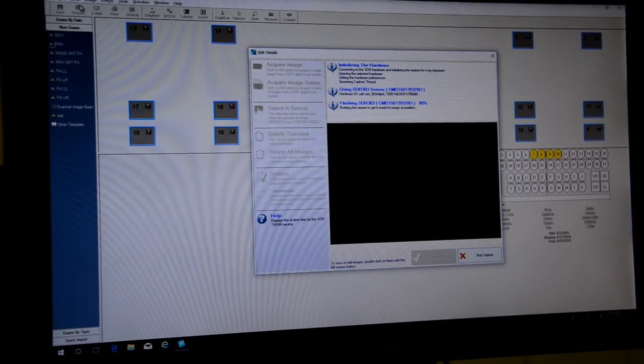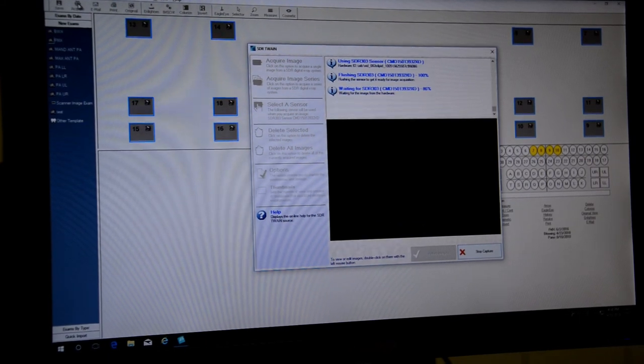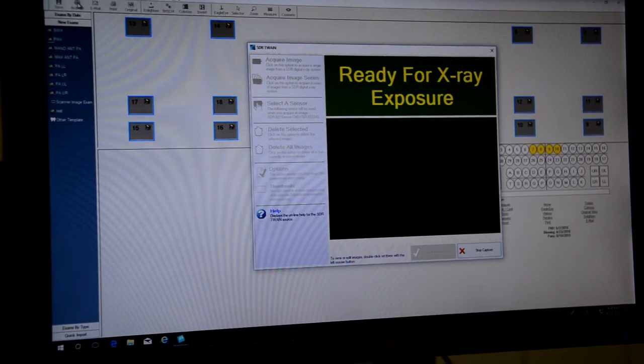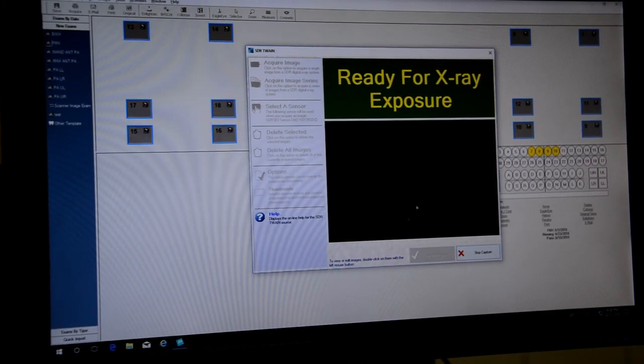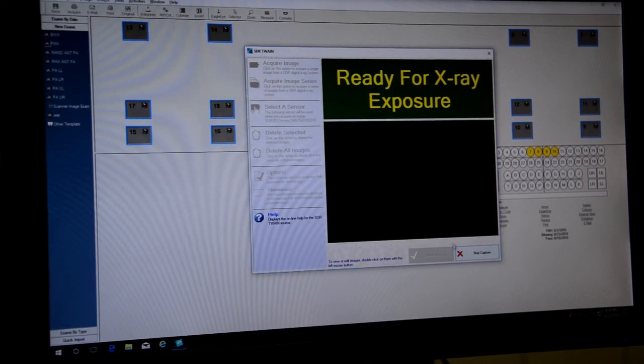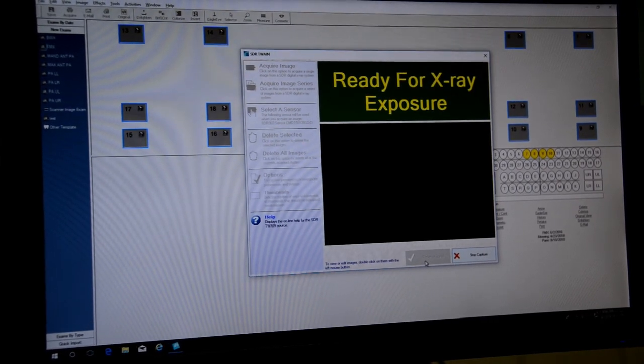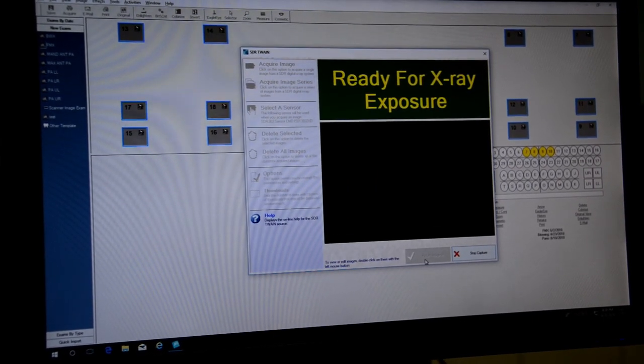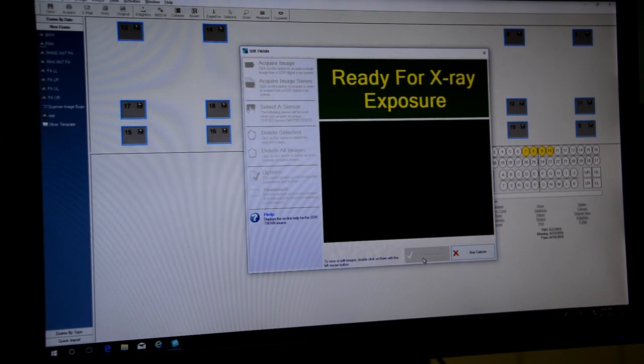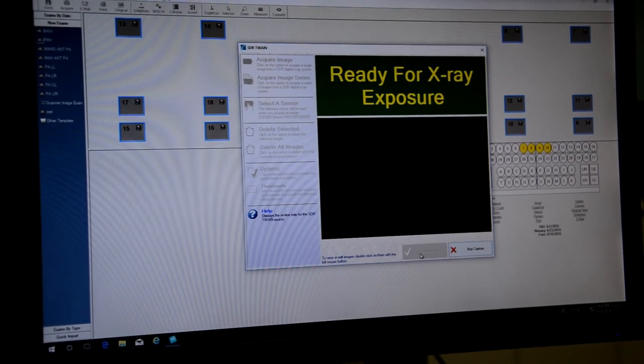Which will initialize our sensor. Take our images. When we're completed stop capture. And the button right here with the that's grayed out with the check will allow us to return those images right into the template with the correct orientation on the images.